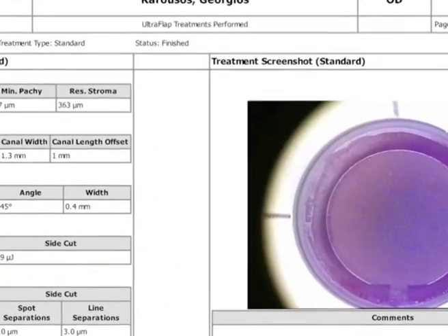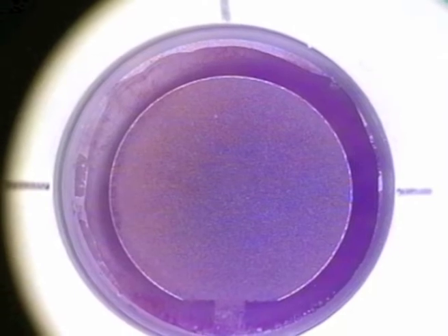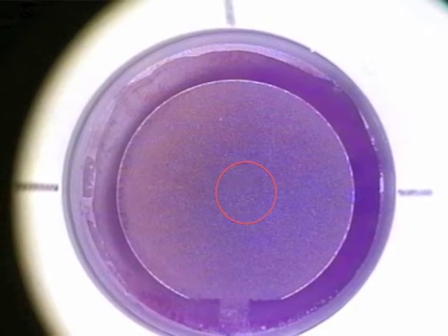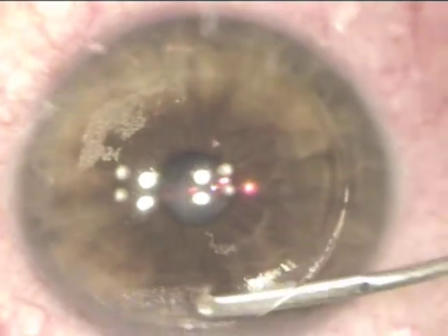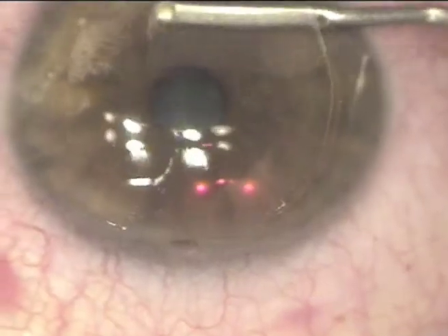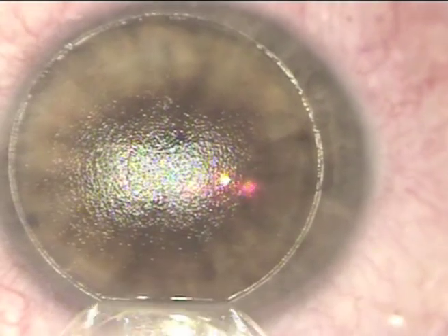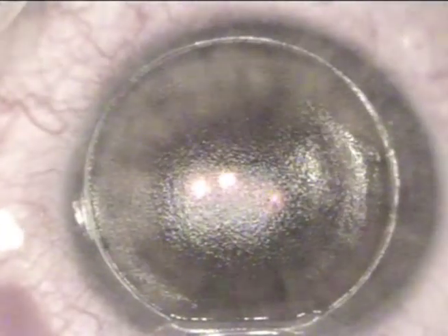You can also see here on the report from the FS200 the actual femto flap. The pupillary aperture shows how the flap is de-centered nasally to match our topography-guided treatment. Using a single-use irrigation spatula — just one instrument in the LASIK procedure — I carefully return and reflect the flap onto itself. Here you can see the hyperopic ablation and how it fits perfectly in this nine-millimeter femto flap.